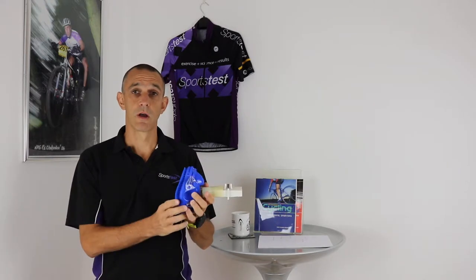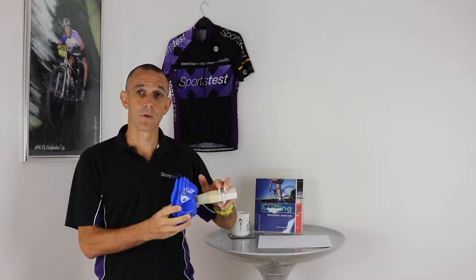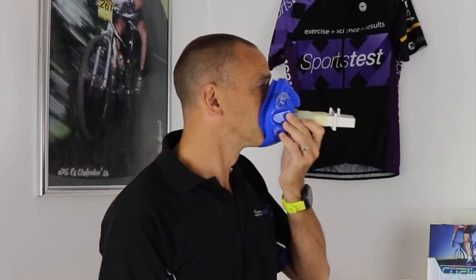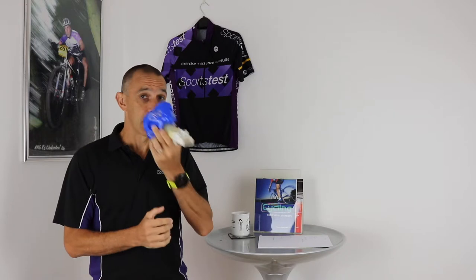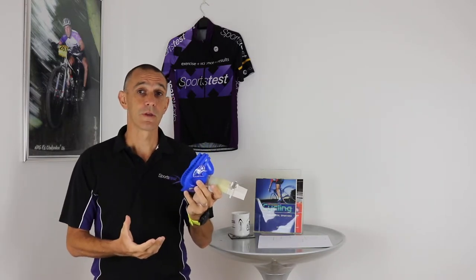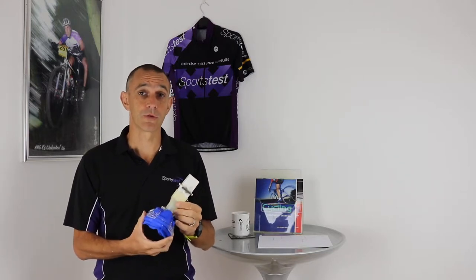During testing you're going to be wearing a face mask like this one here, and there are various tubes that will come out of it that connect to my gas analyser. This goes over your mouth and your nose, and it really shouldn't have any impact on your ability to breathe. It's actually designed as a medical system for respiratory patient use.